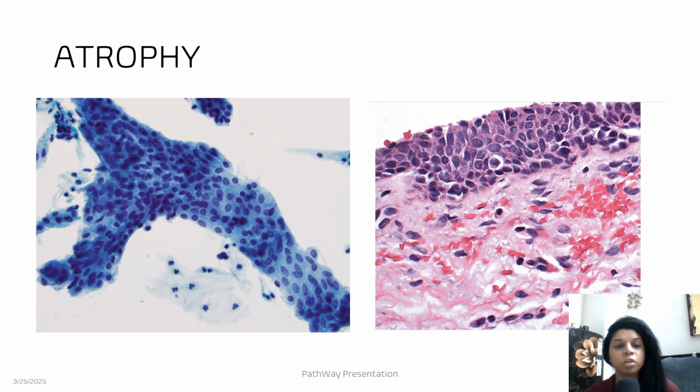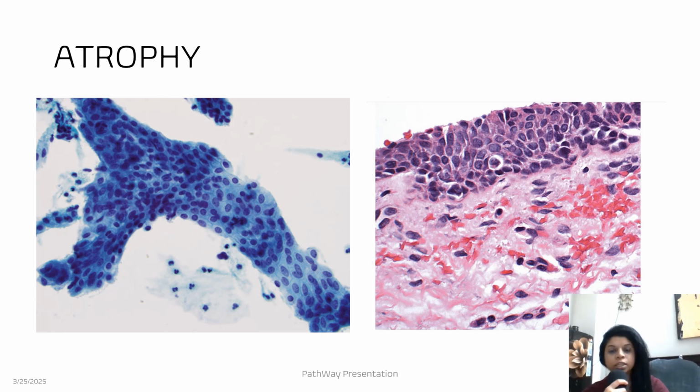Next is atrophy. In this atrophic slide, on one side I have shown the histopathology and on the other side the same pap smear. See how the parabasal cells are. There are darker basal cells also. Then you can see the parabasal cells and how high an NC ratio they have. These cells are seen mostly as a syncytium, so you cannot differentiate the cytoplasmic borders at times.